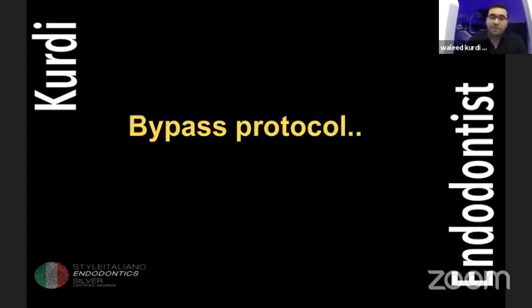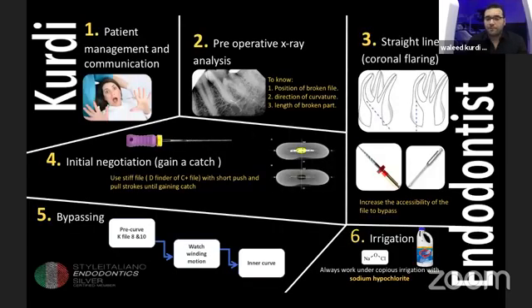All right. Now we are going to talk about our bypassing protocol, the catchy part. But first, I hope this protocol will be a feasible, teachable, repeatable protocol. Now, the first step of our protocol is patient management and communication. You have to tell your patient everything, including the complexity of the case. It's better to have an early appointment when you are not fatigued, you are in full mood. If some music will help, it will be okay. So this part is really very important.